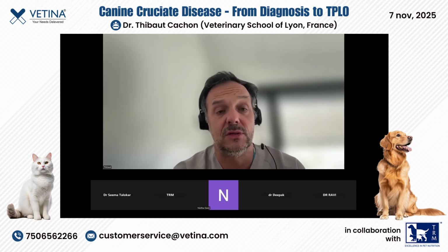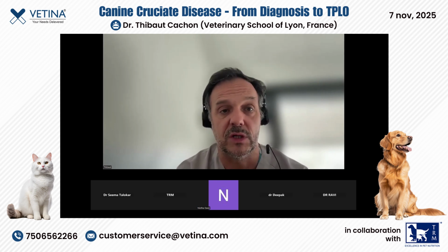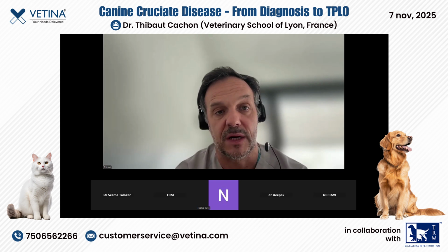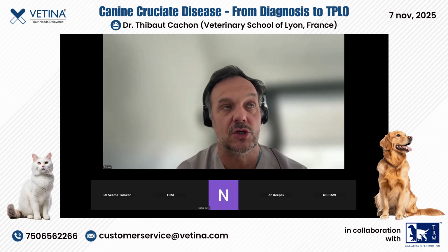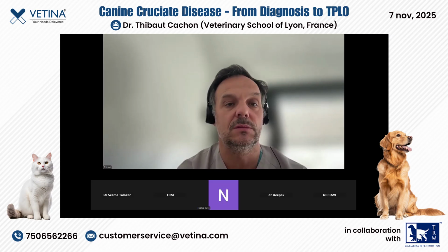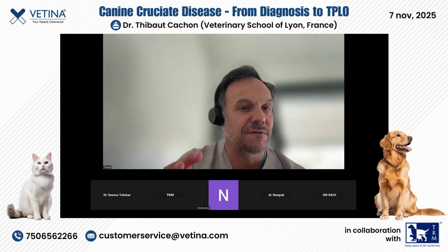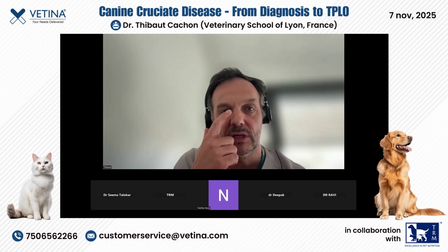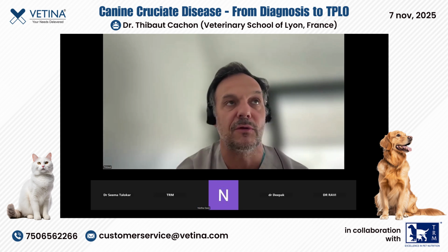I would say that as soon as you get instability of the stifle, TPLO could be done, whatever the size of the tibial plateau slope. But you need to adapt your surgery if you get a very large tibial plateau slope. If you get more than 34 degrees of tibial plateau slope, you need to modify the TPLO a little bit to avoid any risk of tibial crest fracture and implant failure.